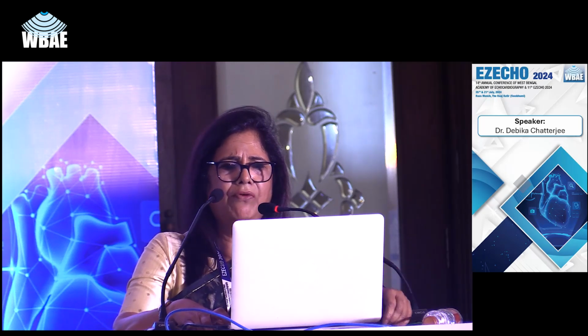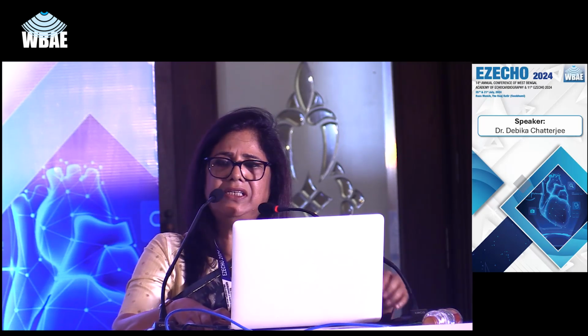There comes the role of assessment of diastolic function. We see that it's a pseudo-normal pattern, and the average E by E prime was 20, which is much more than 14. So he is basically in diastolic heart failure, and the treatment was started accordingly.